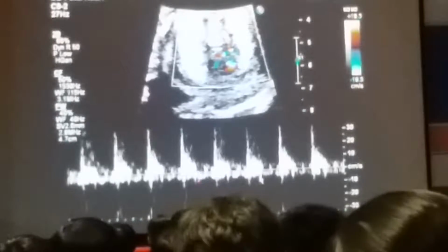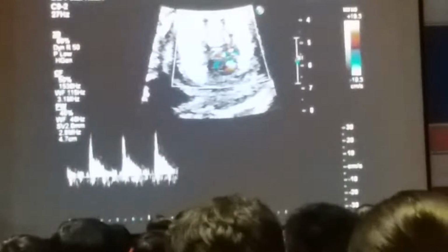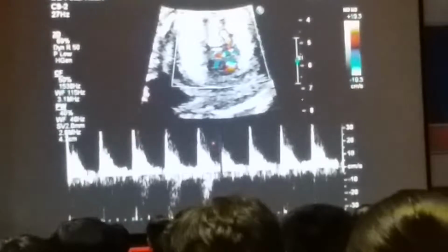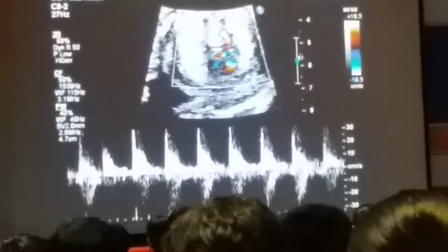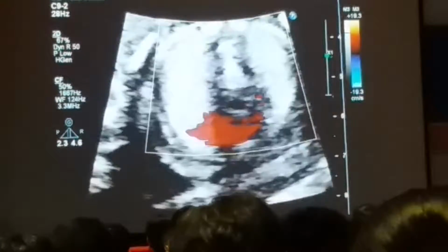E and A. It's not the best pulmonary vein signal, but it's good enough. So we know that there's a beautiful artery signal. That is characteristic of what you see after birth with pulmonary hypertension. And then I'm coming into the aorta.